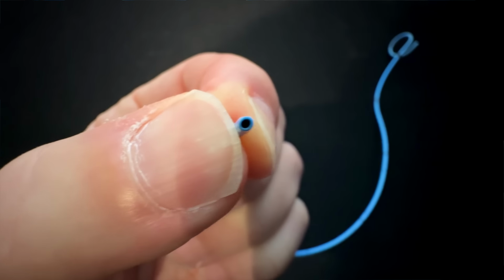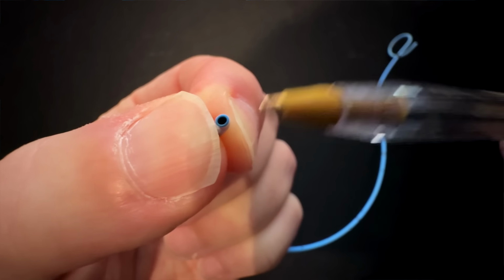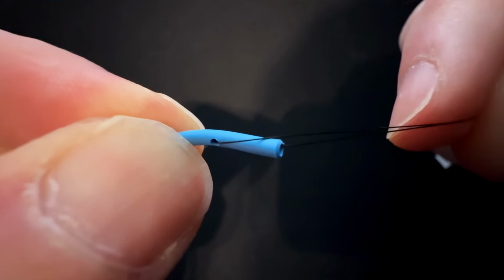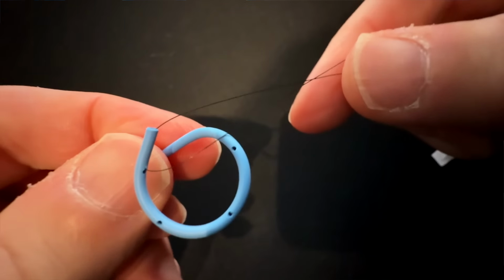So here is the actual stent that I pulled out earlier on. And it's very, very thin. If I put it down to the camera, you can see that the hole is only about 1 millimetre or 2 wide. If I put this ballpoint pen up against it, you can see how small it is. And it also has this thread, which I thought was cotton at first, but it's actually like a nylon or polypropylene string, which makes sense because it makes it more durable, and I'm guessing it lowers the risk of any infection, which is something that I was worried about because that comes out of the end of your willy and it's taped to the side of your willy.